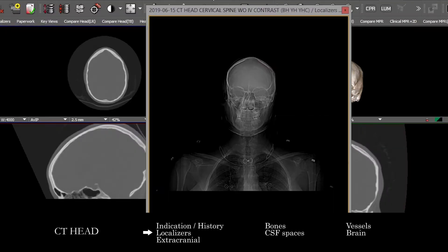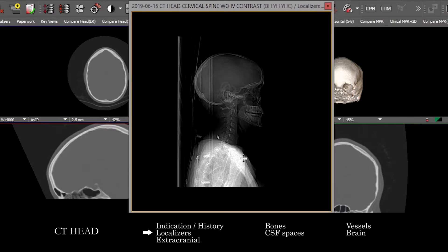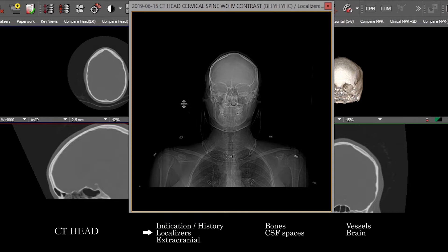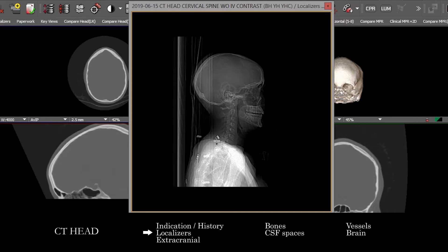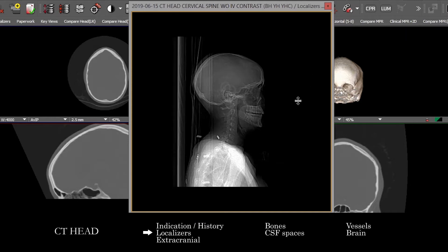It's good first to take a look at the localizer images, and particularly if on the localizer images we're seeing portions of the upper chest — look at the osseous structures, look at the lungs, make sure there's no mass lesion, no fractures, no obvious gross abnormality there. And sometimes we'll also see the cervical spine, depending on the localizer image.